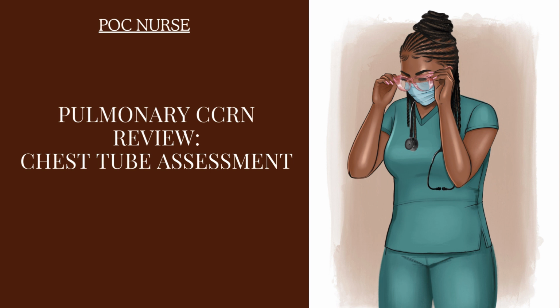But when it doesn't matter if the patient is breathing in or breathing out, you just see bubbles in the water seal chamber, that is a continuous air leak. Anytime you see an air leak, you want to let the provider know. When you see that tidaling is not occurring, you also need to let the provider know, especially if you've investigated the tubing, you don't see a source of air leak, and you don't find any explanation why there is no tidaling.